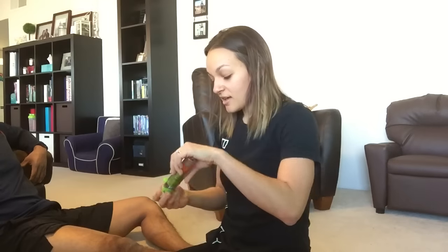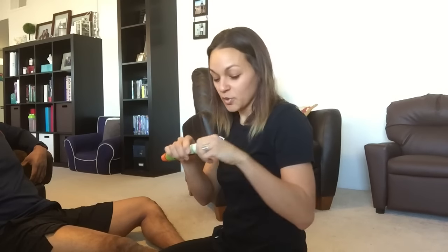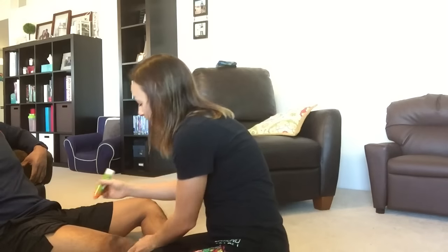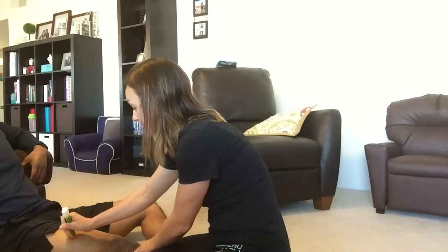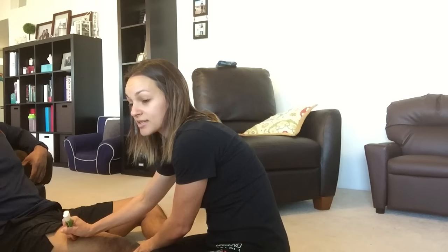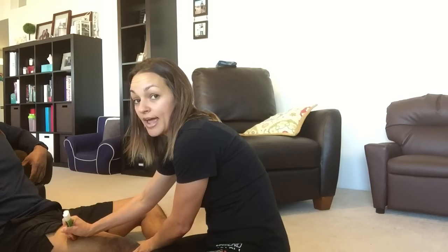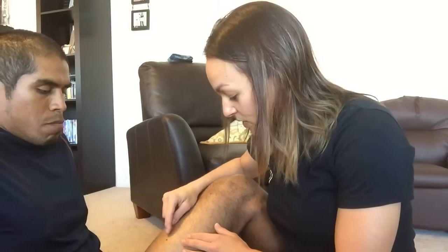This is the actual epinephrine. I have to pull the blue top off, put it on his thigh, and push till it clicks. You can see there's a tiny little dot of blood right here — that's where the needle went in.